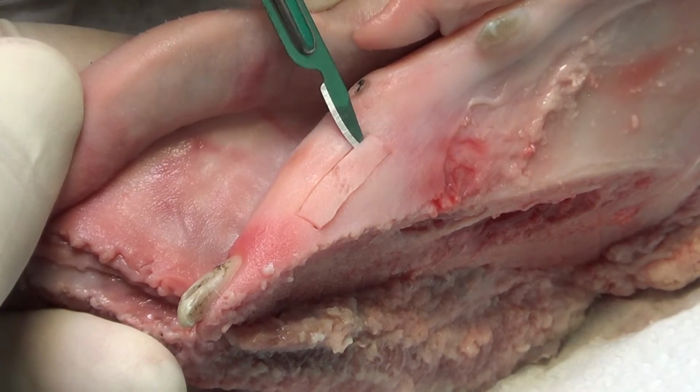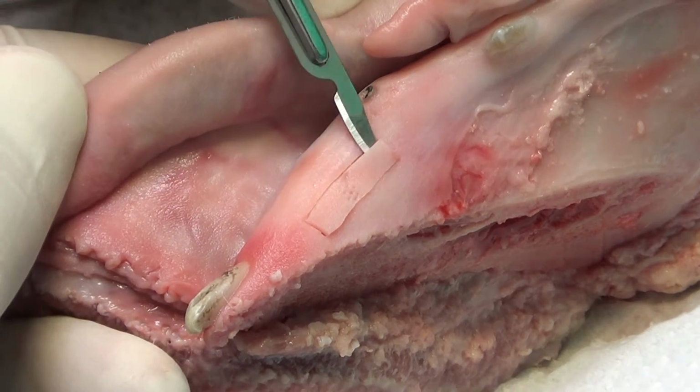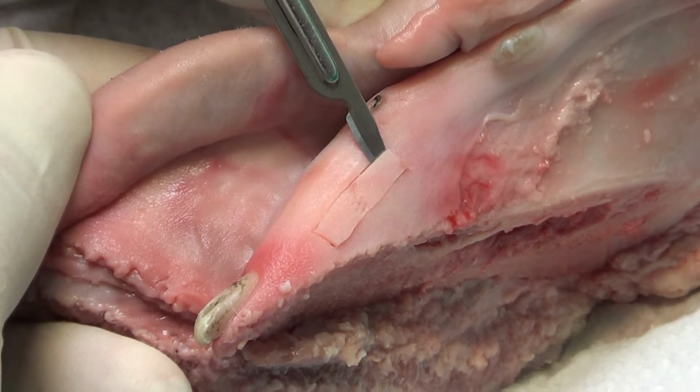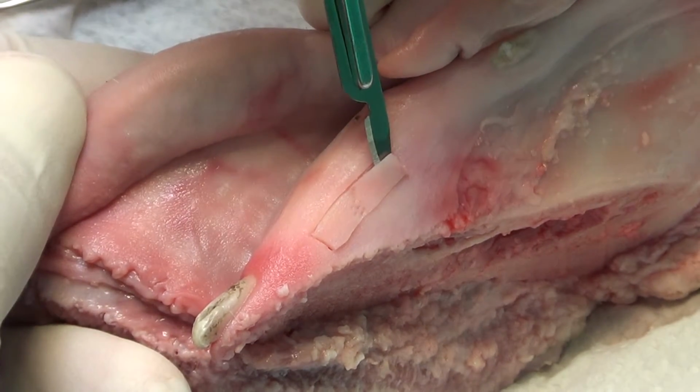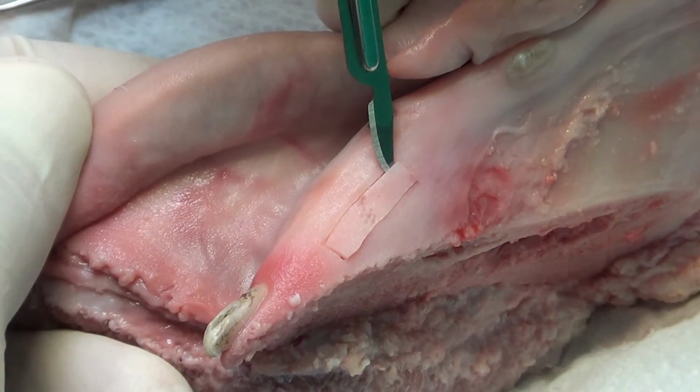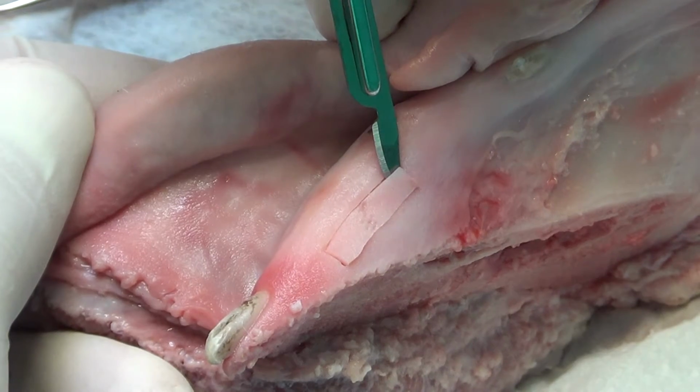If you maintain the blade in that direction, you obtain a perfect thickness of the tissue. But if you move like this, you obtain in the coronal part 1 mm, in the apical part 3 mm.